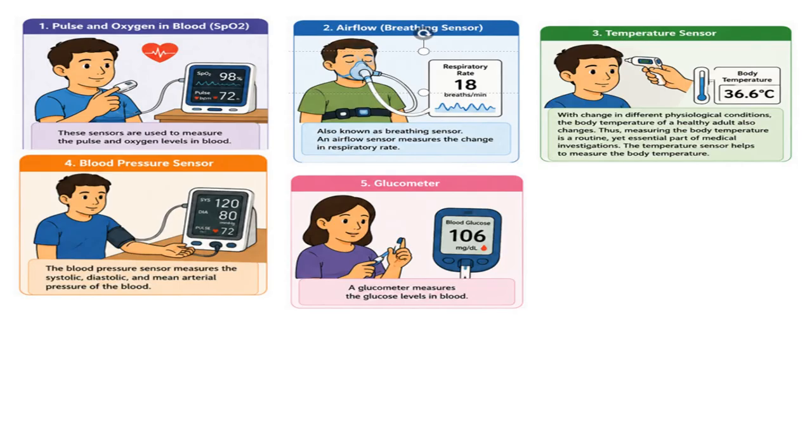By tracking the glucose trends over time, doctors can adjust medications, diet plans, and lifestyle recommendations to improve diabetes management and the patient's overall health.